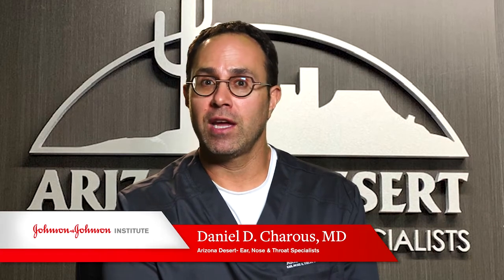The name of our practice is Arizona Desert Ear, Nose, and Throat Specialist, and today we're going to be talking about in-office sinus procedures using the Acclarent TruDi navigation system.